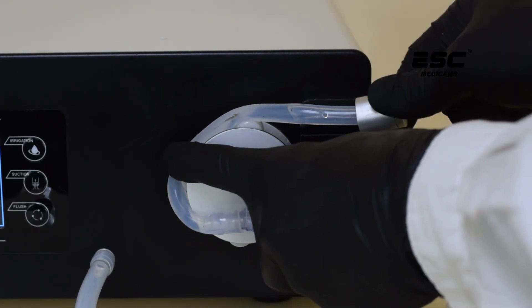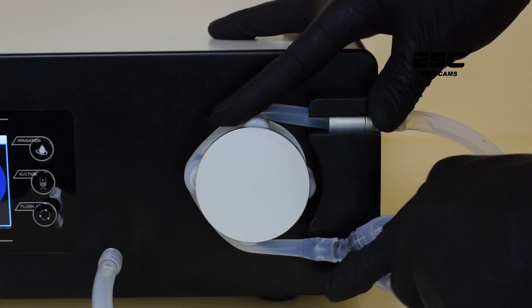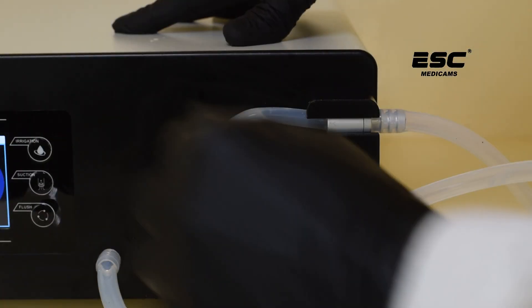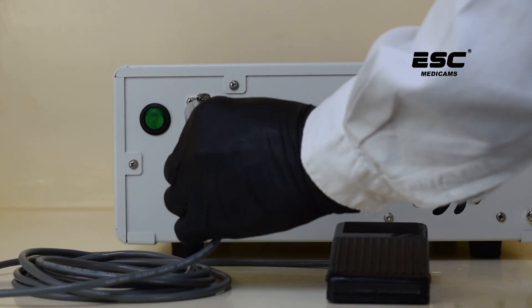Connect the irrigation tube with Y-Connector and roll over the pulley. Connect one end of Y-Connector to the pressure sensor nozzle. Connect the foot switch at the back with the pointer facing upward.